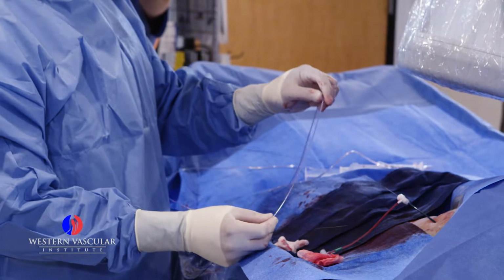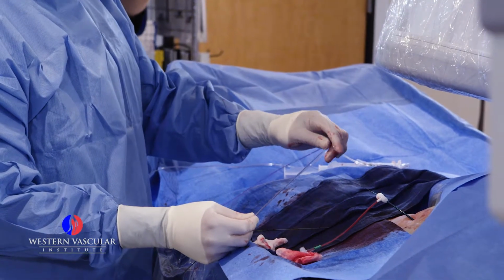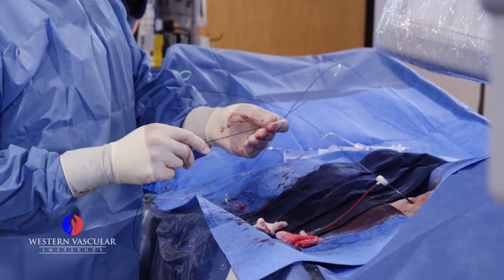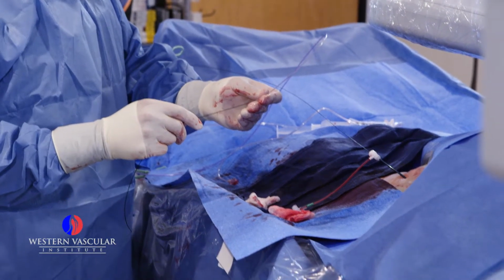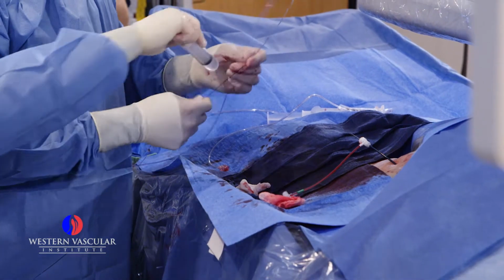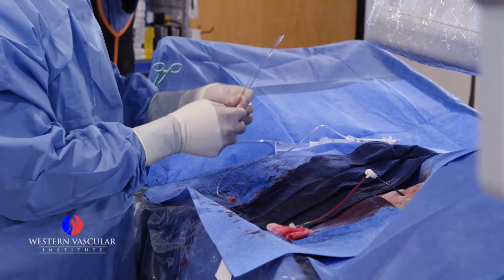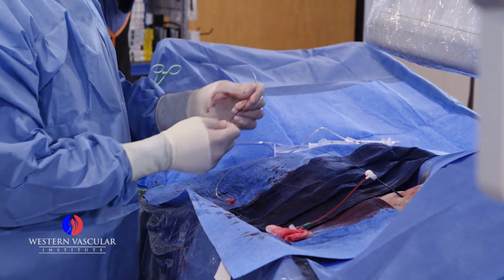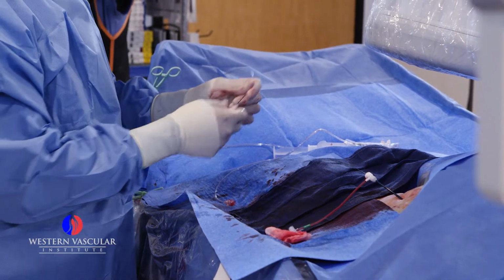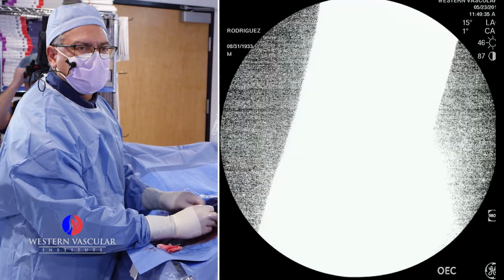This is a very long balloon. It goes from the tip of the catheter up to this point where my fingers are. It's almost 20 centimeters long. It's tapered at the end, so that allows us to navigate through the plaque. For sure, we will feel some resistance moving this device down, but we're going to try to dilate it little by little until we get to the lower portion of the femoral artery. As you can see, we use the wire as a guiding tool.